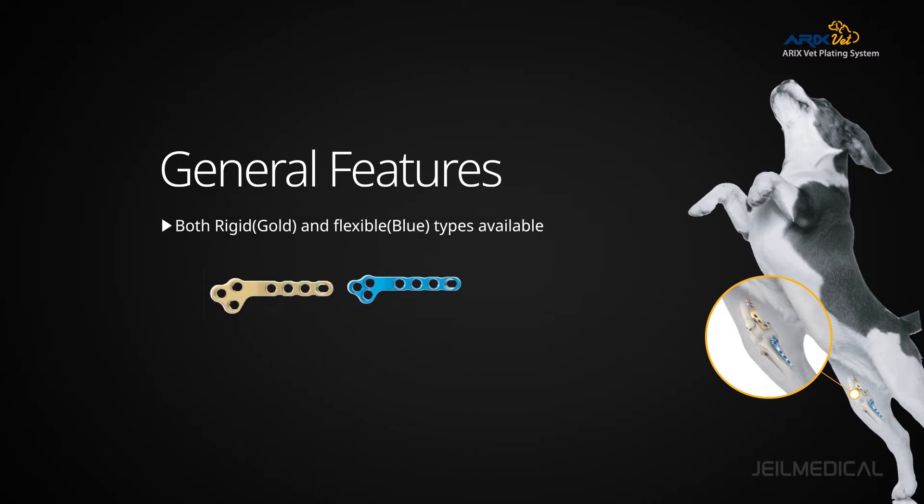There are left and right versions when choosing a plate, and rigid type and flexible type are available in gold and blue colors.